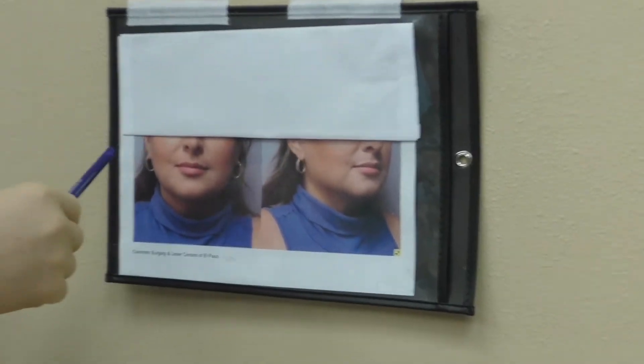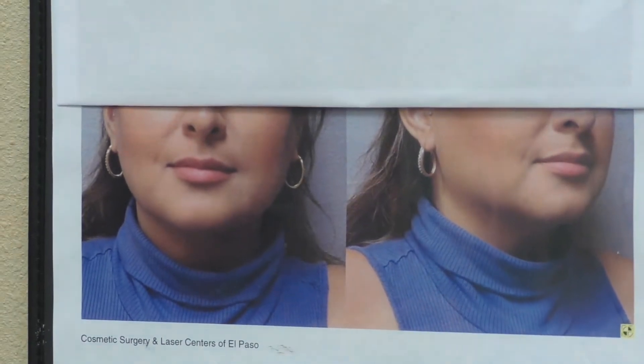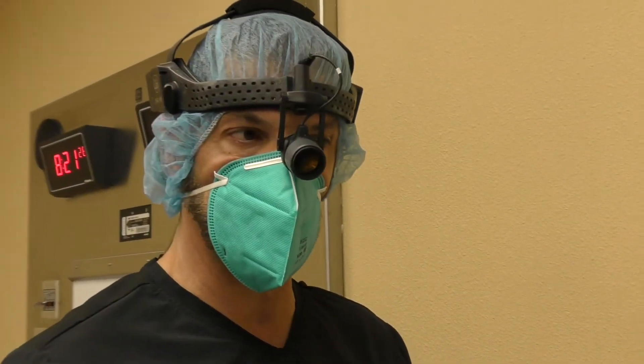Here's the patient. She's had lip fillers before. She has very nicely shaped lips but does not want to keep or continue to have lip fillers for the rest of her life. She'd like to do something a little bit more permanent and have a lip enhancement. We've talked about it and chosen to do a lip augmentation. I'm going to show you some of the key steps as we go along, and I'll show you the implant.